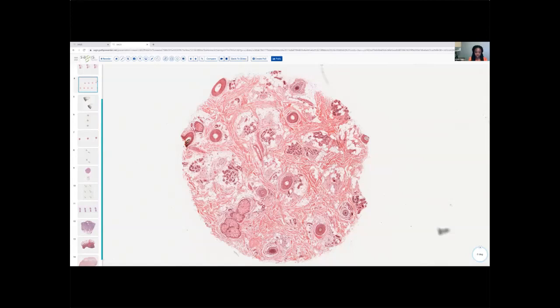They know that's a sequela of that miniaturization process, but we don't have concentric thick scars, so we're non-scarring, in a non-scarring alopecia. We do have some catagen-telogen shift. So we have quite a few of our hairs that are represented have gone into the catagen-telogen phase. And there are numbers to all this.